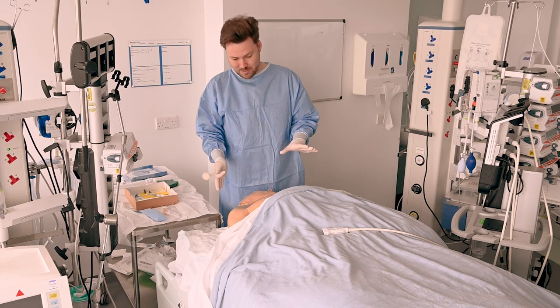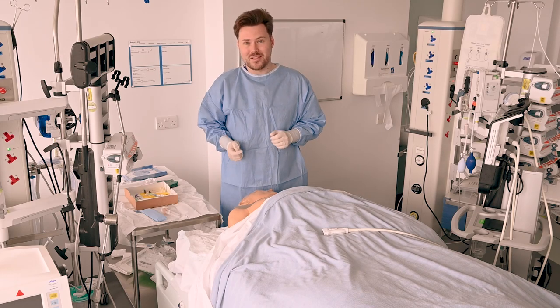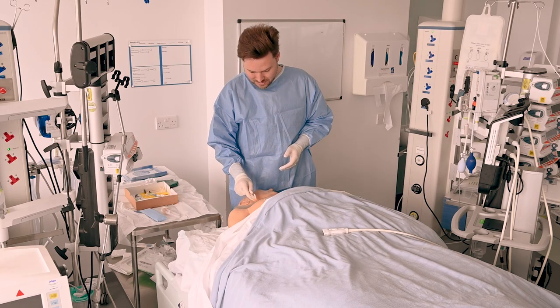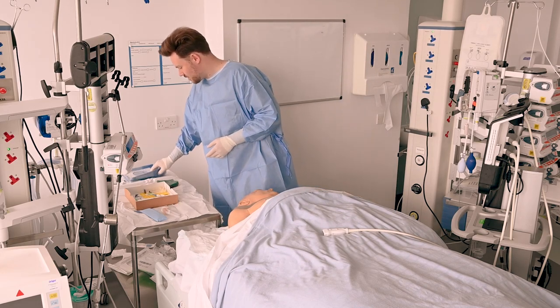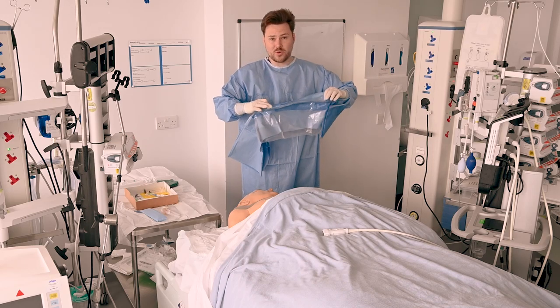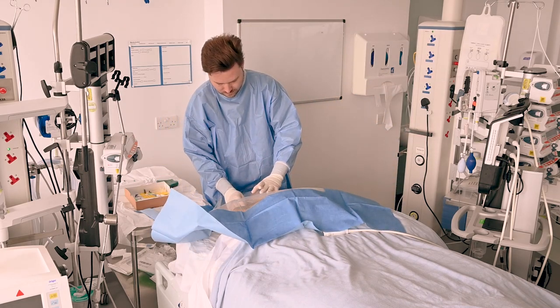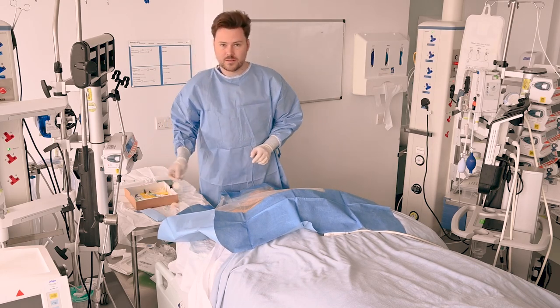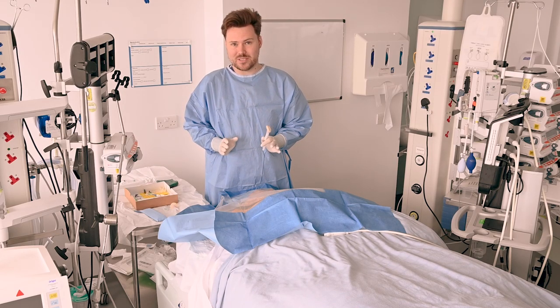Next thing we're going to clean. I've set up the patient with a slight head down which, if they can tolerate it, will make your life a lot easier for internal jugular lines. There's an inco pad underneath their shoulder and now I'm going to start cleaning. I'm going to dispose of this carefully off to the side and then apply the sterile drape. Then I'm going to clean again and allow that to air dry, making sure that the site is as clean as possible as this should be a sterile technique.